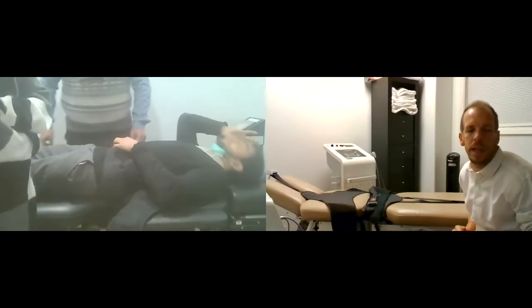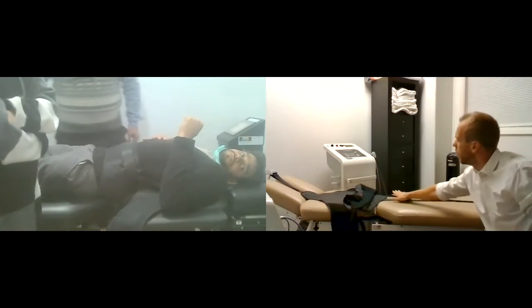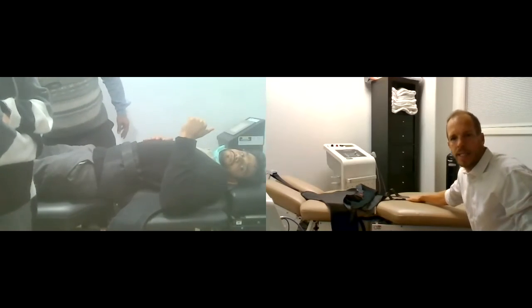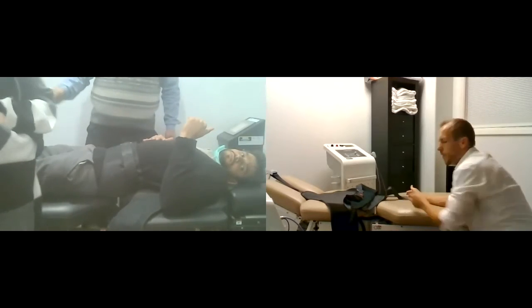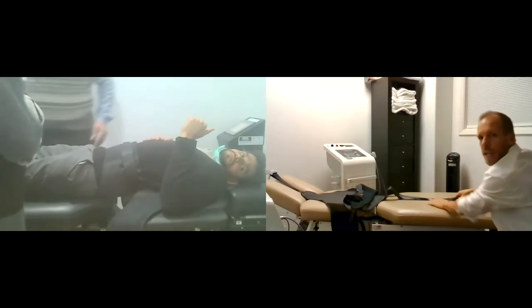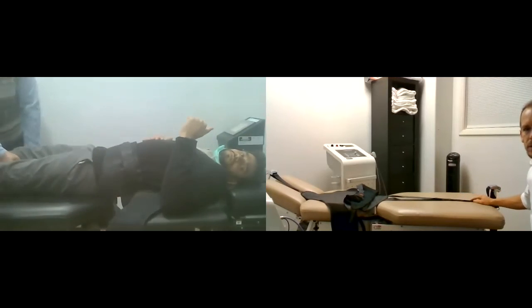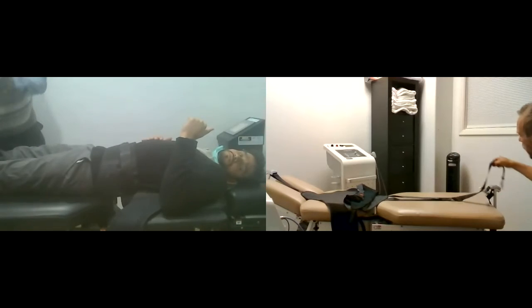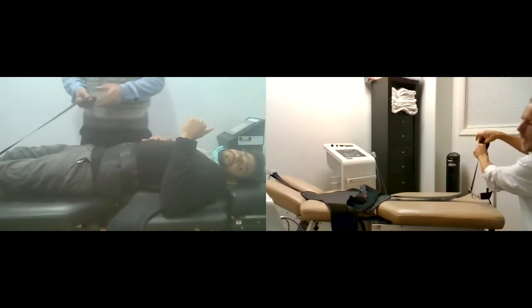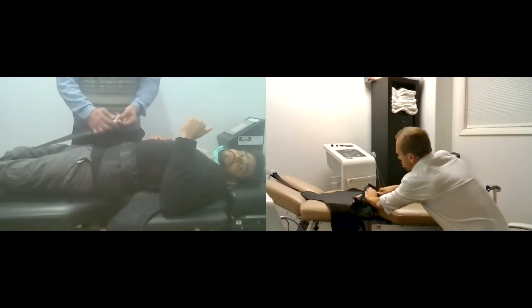It's centered now. Okay. Next, what you want to do is you want to follow this strap here. Now, when the patient sits on it, it tends to get a lot of extra fabric underneath here. Okay. So grab here and pull away from the patient to pull all that slack out. Okay. And then you're going to go through this ring. Got it. And then back up and attach to the ring around the waist.